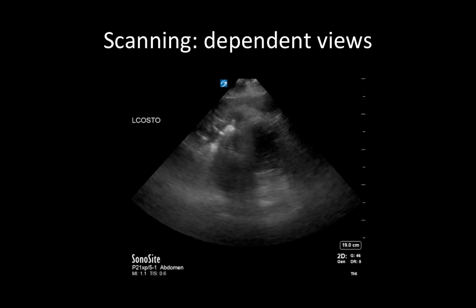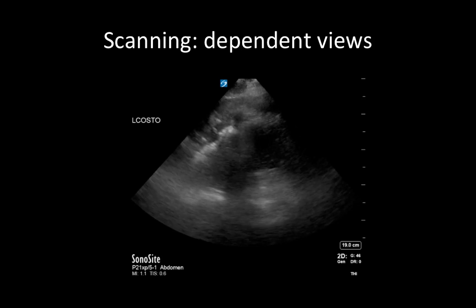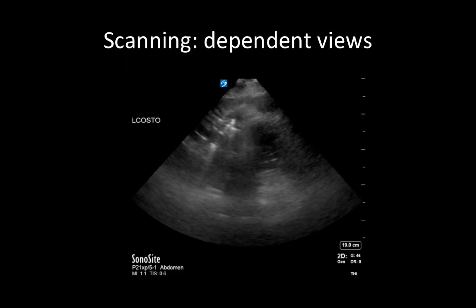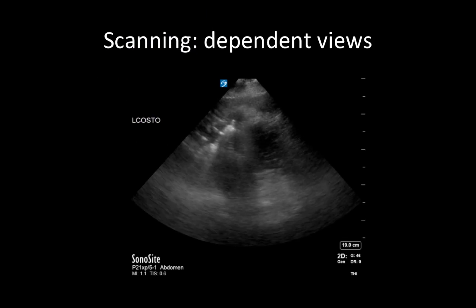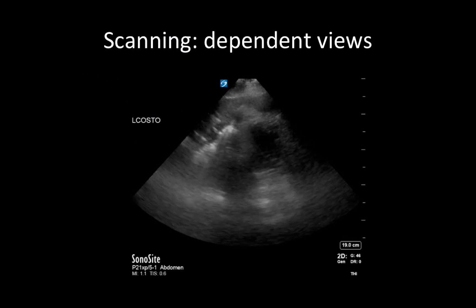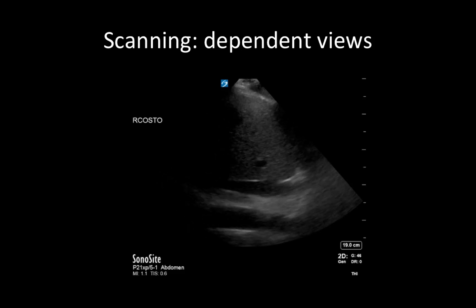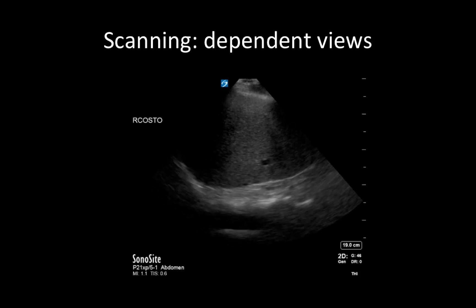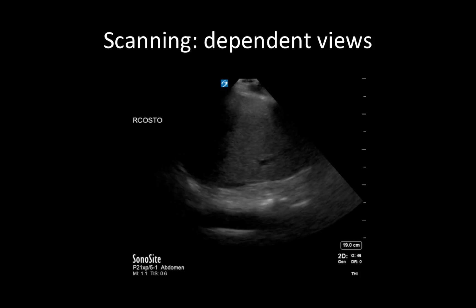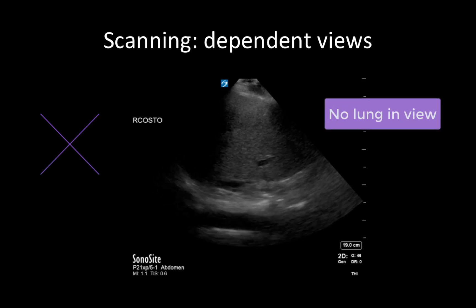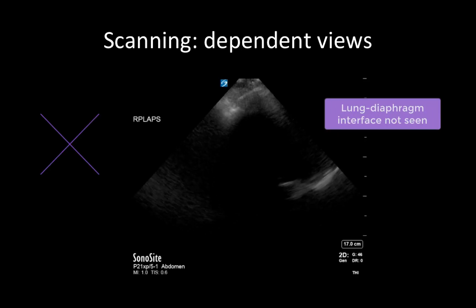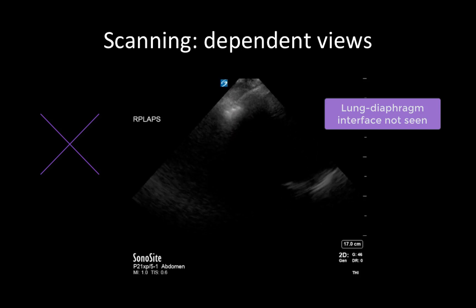Scanning the dependent views is often the most challenging. Always start by clearly identifying the diaphragm if possible, as that will allow you to identify whether you are in the abdomen or in the thorax. Always make sure that you are visualizing both the solid intra-abdominal organ — the liver on the right or the spleen on the left — as well as the lung above it. If you are too far caudal, you won't see any lung in your view. Another common mistake is to have the lung–solid organ interface obscured by a rib shadow, which is more common with a curvilinear probe due to the larger footprint.